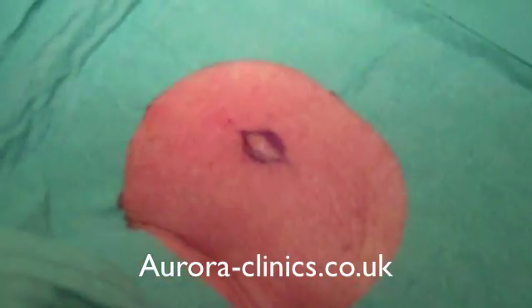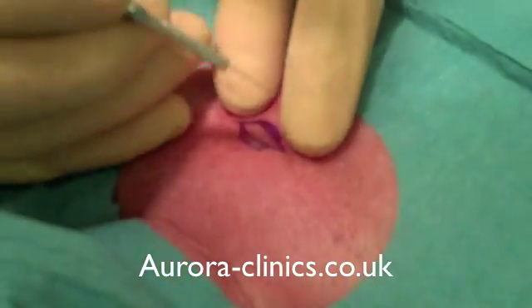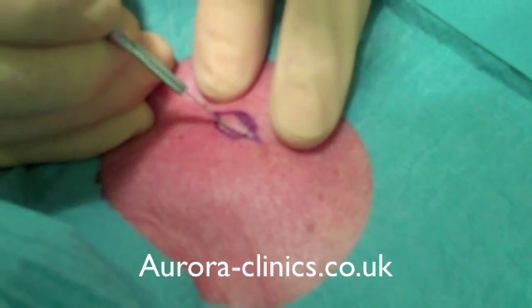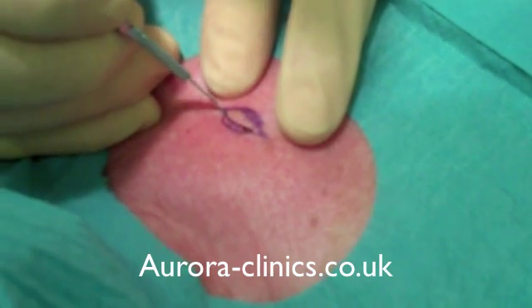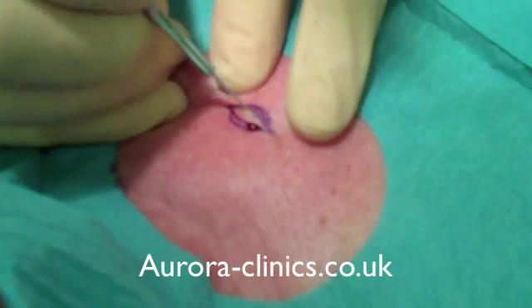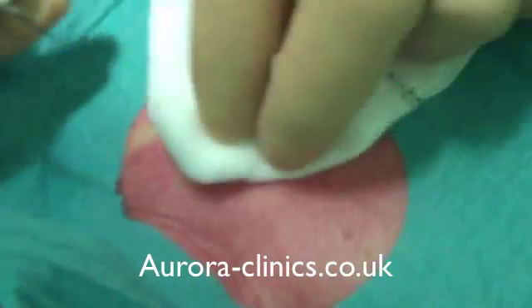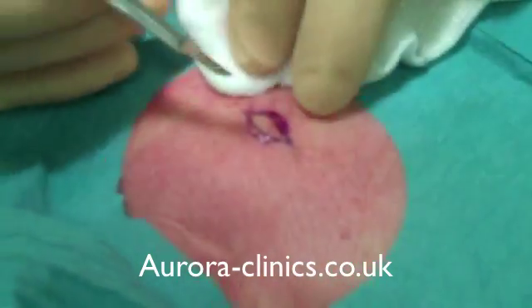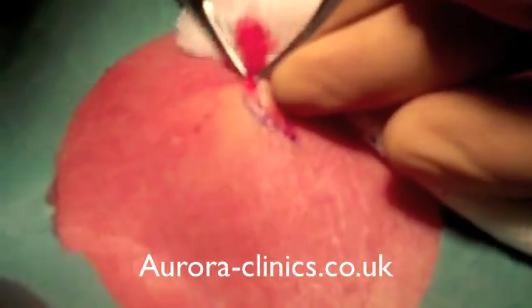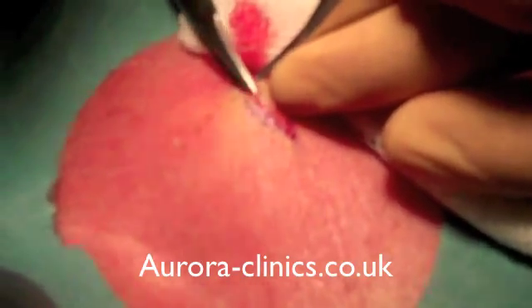It's very important to look out for a punctum, which is basically an open pore, and include that in your ellipse. It might be slightly off-centre but do include it, because that's the opening for the cyst. So I just cut through the skin initially there.